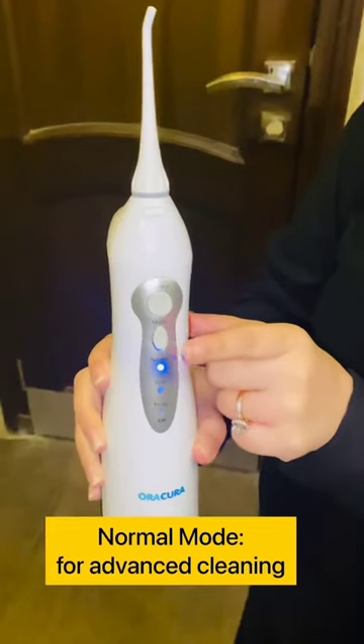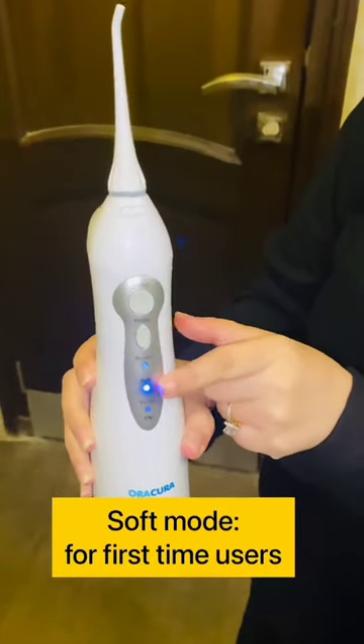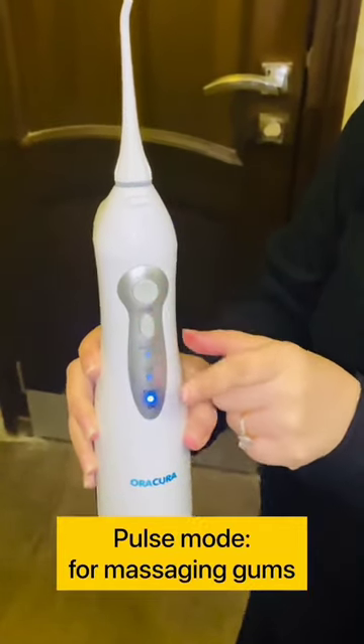Select the mode. Normal mode is for advanced cleaning, soft mode is for first time users, and pulse mode is for massaging gums. That's also where you find the on and off button.